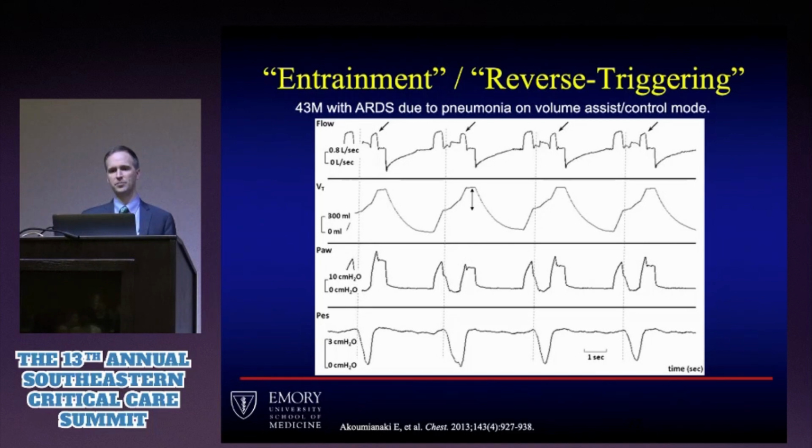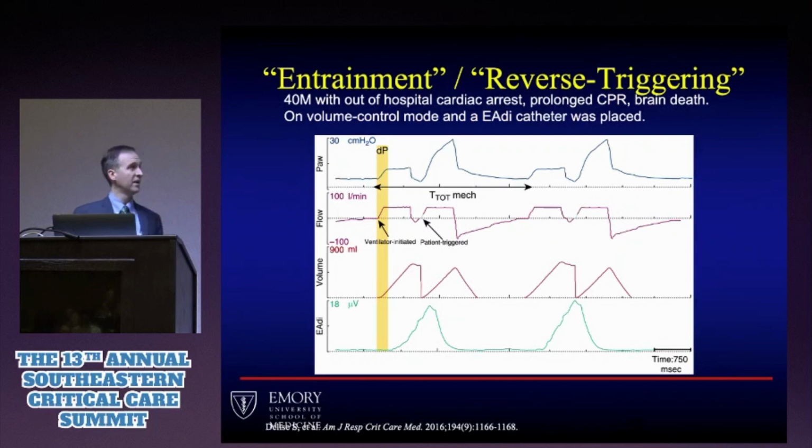It's more common in deeply sedated patients. And sedating the patient will not make those double triggers go away. That's what's usually done, but it won't make it go away. This is a case, I'm going to skip through it really quickly, but this is a patient who actually had out-of-hospital cardiac arrest, had prolonged CPR, was brain dead.